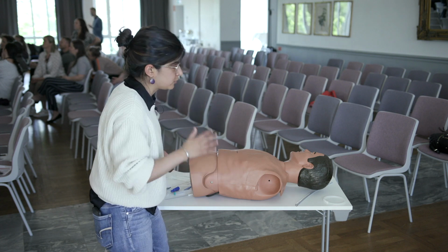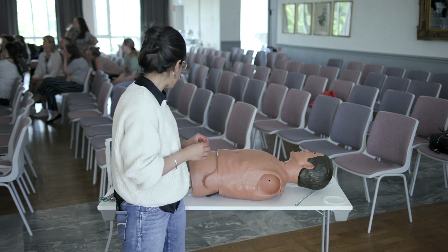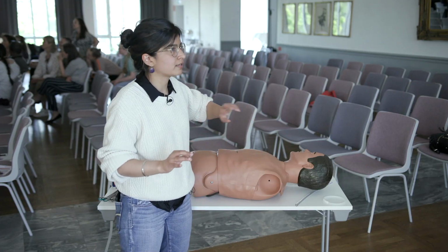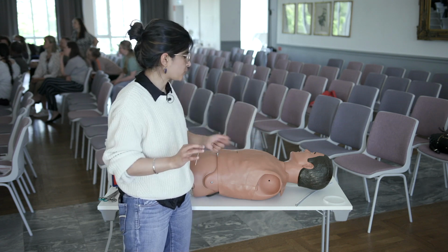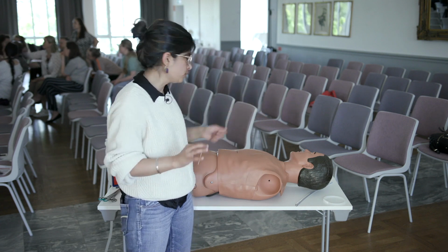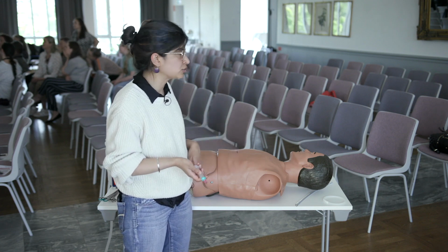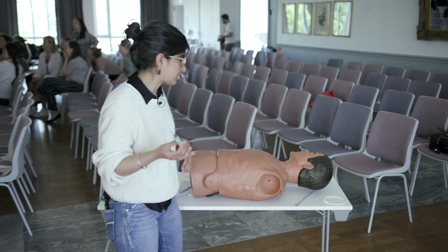So you've identified your pocket, you've identified that this patient needs a drain, and so you do the same steps. You gown up, full sterile precautions, you've cleaned the area, you can put your ultrasound away because you know where you're going, or you can put a little marker on the skin for where you think your needle's gonna go. You've taken some lidocaine, you've numbed your patient, and while the numbing is taking effect, you set up your kit.